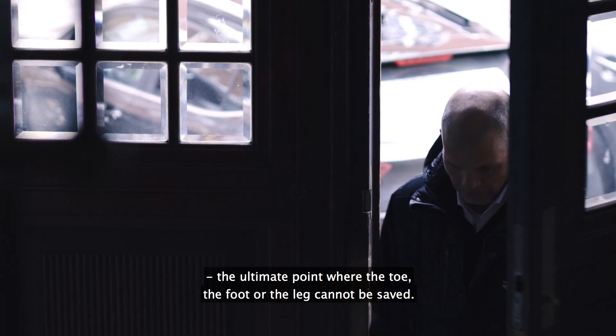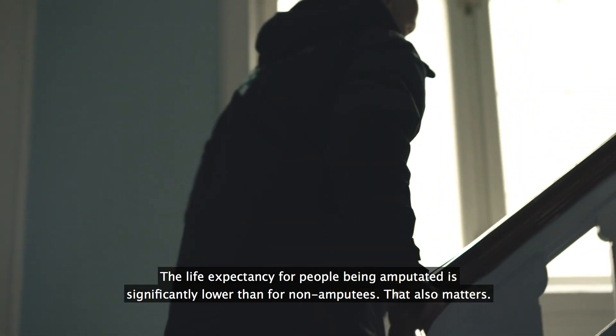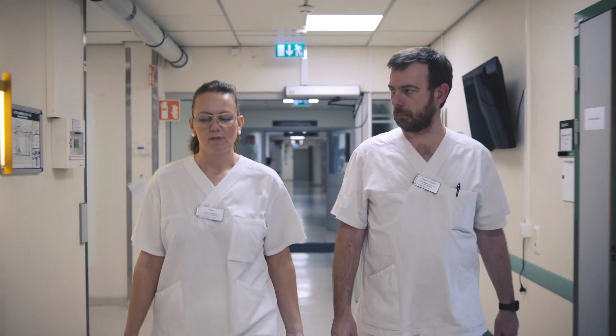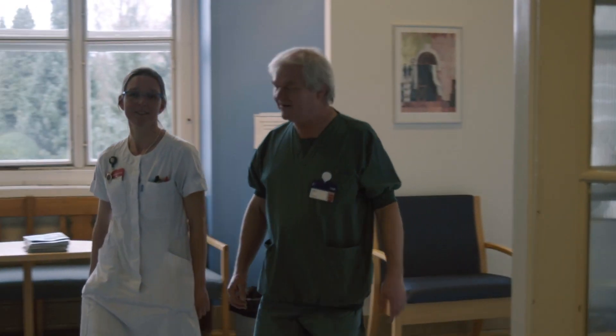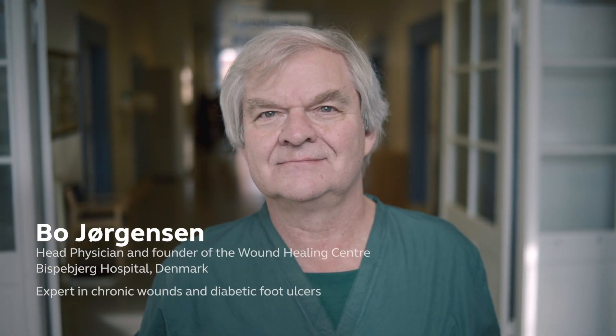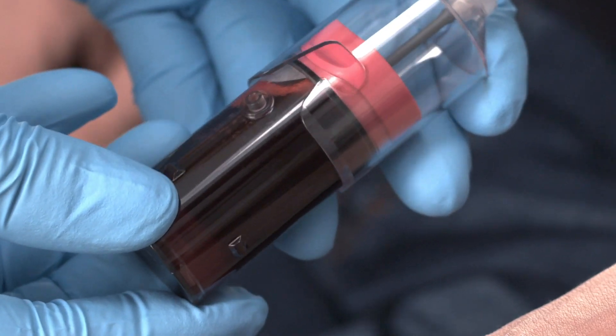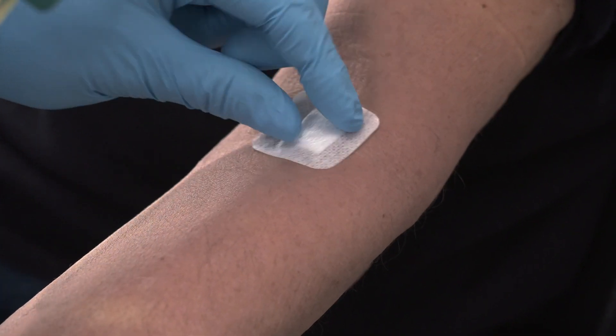When I first heard about the 3C patch, I thought, this is strange. We were using the patient's own blood. But on second thought, it's rather brilliant. Because what we are using is the patient's own growth factors, own leukocytes, that for some reason can't be distributed to the ulcer area by the patients. The concept — using our own blood to treat our own ulcers — is very special, but also very sophisticated. It is a very natural way to put your own growth factors in the ulcer and, in this way, to accelerate the healing.